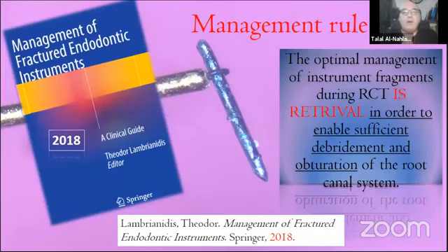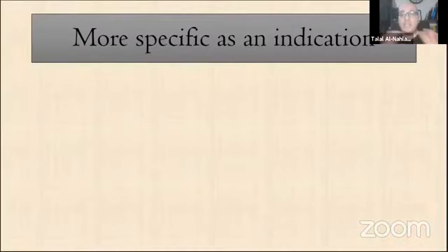Okay, now I'm going to speak about the other treatment modality, which is broken file removal. I believe that removal of the broken file from inside the root canal presents the best case scenario in terms of better debridement and better obturation of the root canal, in order to give us a better healing potential at the end. This is in general, and this is according to the literature.